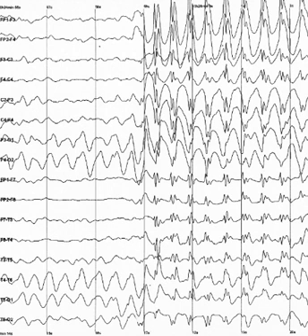Focal non-epileptiform abnormal activity may occur over areas of the brain where there is focal damage of the cortex or white matter. It often consists of an increase in slow-frequency rhythms and/or a loss of normal higher-frequency rhythms. It may also appear as focal or unilateral decrease in amplitude of the EEG signal. Diffuse non-epileptiform abnormal activity may manifest as diffuse abnormally slow rhythms or bilateral slowing of normal rhythms, such as the PBR.